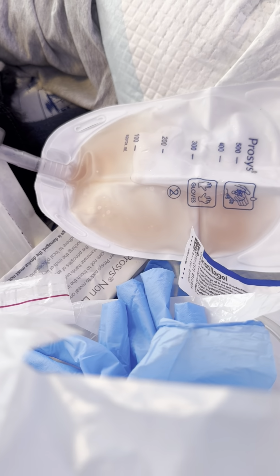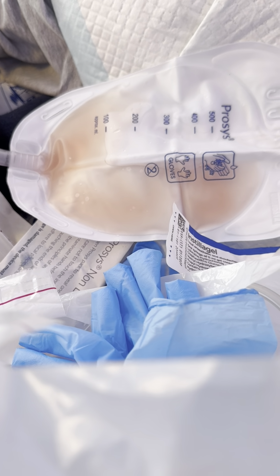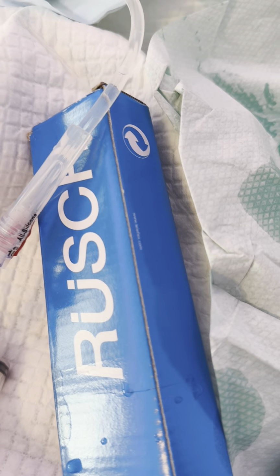And make sure you do your readings. I've not done the SATs, but I will do the SATs now. But yes, that is what you've got as an SPC change. And it is running beautifully.